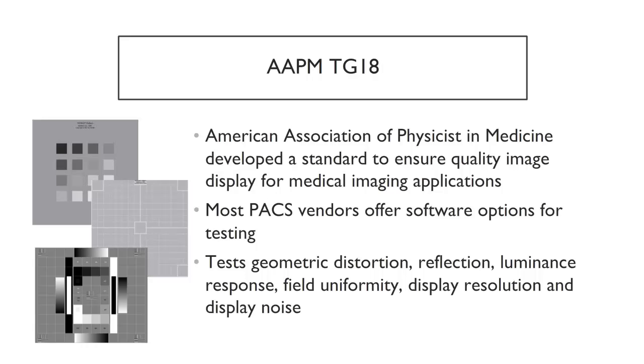These patterns test geometric distortion, reflection, luminance response, field uniformity, display resolution, and display noise. Many monitor vendors are following suit, and test tools are being built into the monitors, and testing is conducted automatically, which results in a report that is generated.